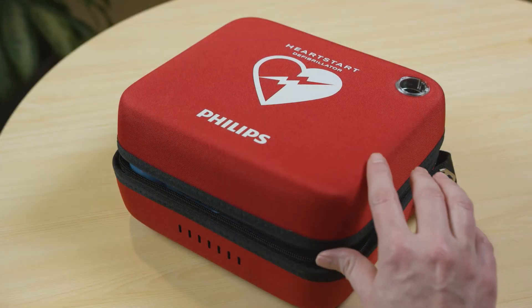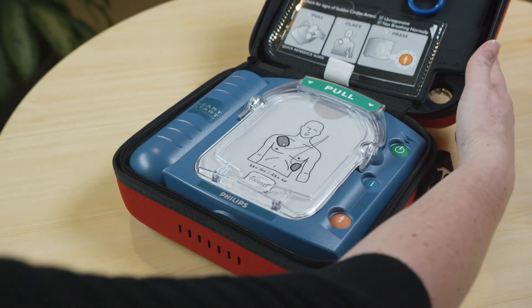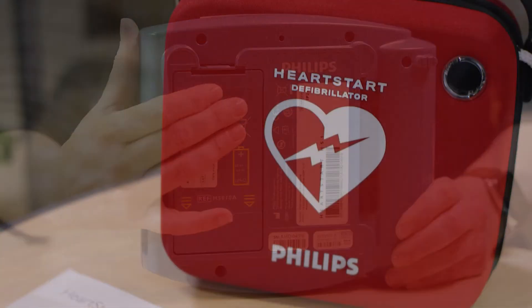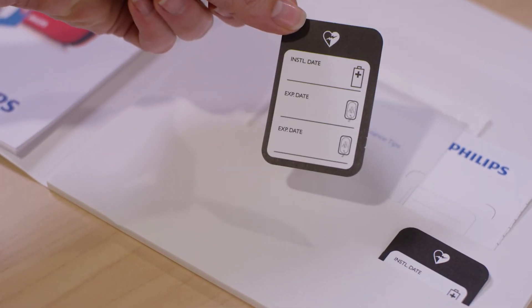In this video, you will learn how to maintain the two accessories that will eventually need to be replaced: the pads and the battery. Each system comes with a simple maintenance sticker to help you keep track of these two accessories.